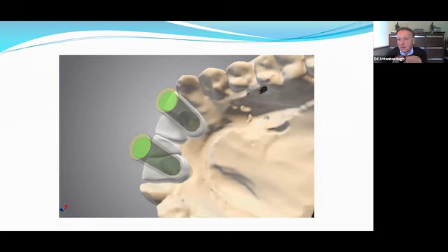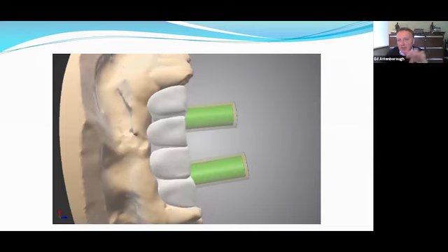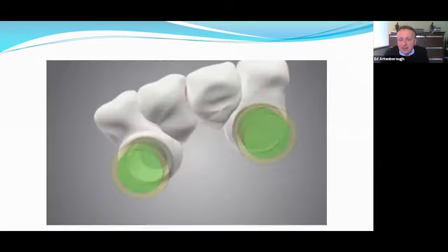So once you've decided where your implants are going to go, we can start to design the restoration, the customized abutments, and in this case, 4-unit provisional restoration, so that they can all be placed in one visit. And this kind of integrated treatment planning really comes into its own when you have an integrated system and software.